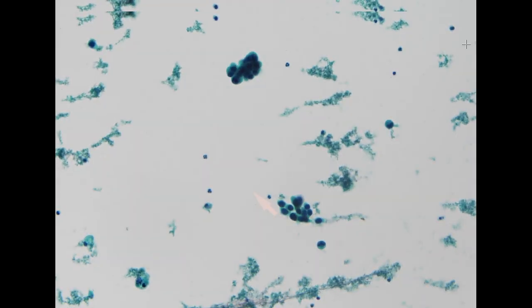So the next specimen is also suspicious for pancreatic cancer from a 72-year-old male. This specimen is also a little bit unusual. First of all, for pancreatic cancer, unless it is under treatment, it's relatively uncommon to see background necrosis.